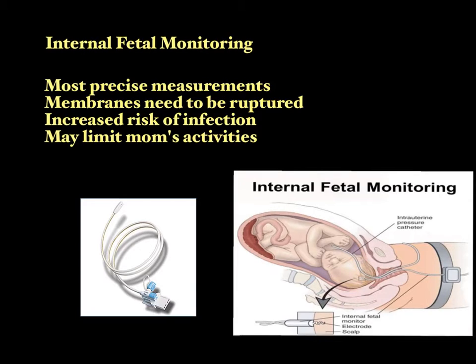And you can see that it's invasive. It goes right into the uterus. So it really needs to be inserted by a licensed independent provider under sterile technique.